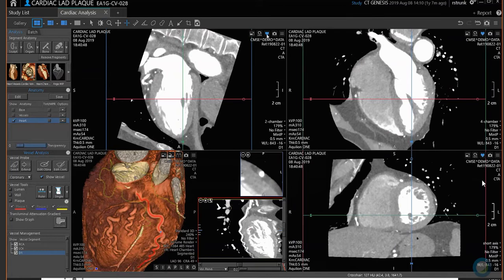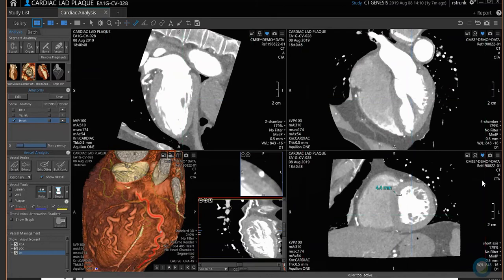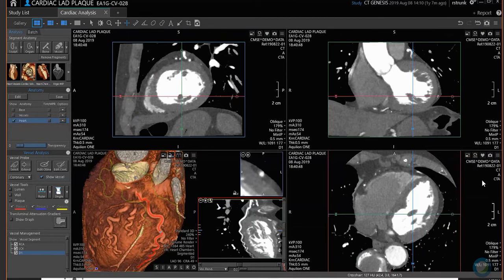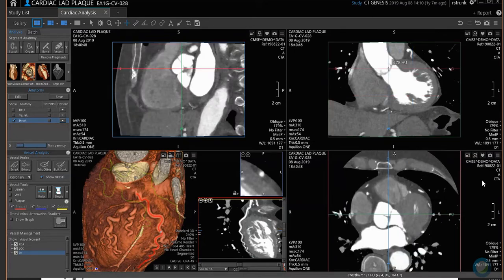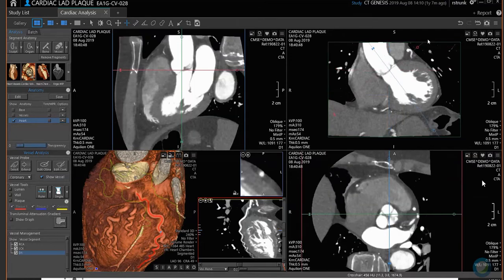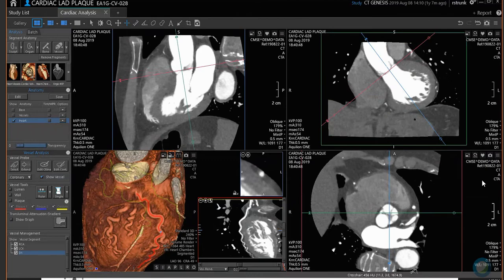That little heart button — if you click on it, it puts the images in two-chamber, four-chamber, and short axis stack. If you did want to look at the myocardium using MinIP, if there was dead tissue from a previous MI it would be darker because there would be no perfusion in it. You can also get your ruler to do measurements. If you uncheck the little heart, you go right back to your previous layout. This works for both retrospective and prospective acquisitions. If you put your crosshair right here — with the red line across the valve — you can start to see the sinuses, which is helpful for measurements of certain structures.